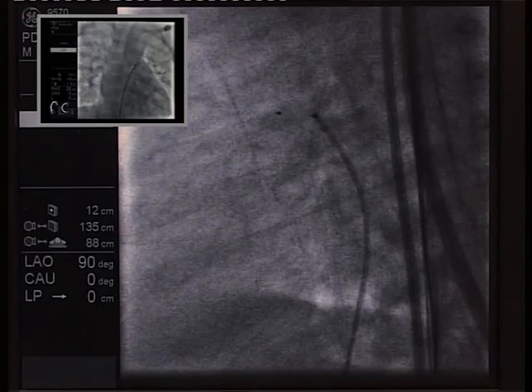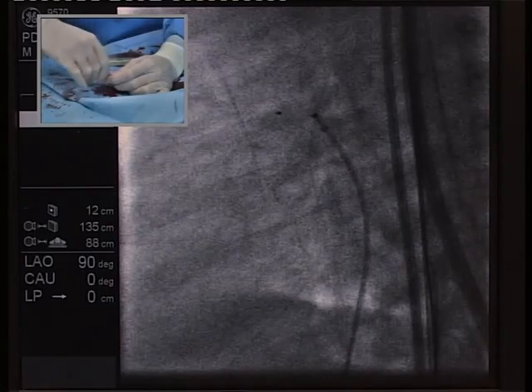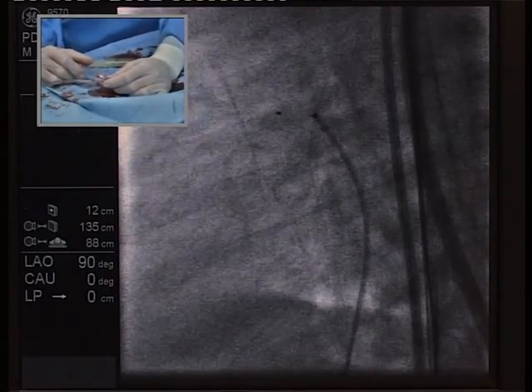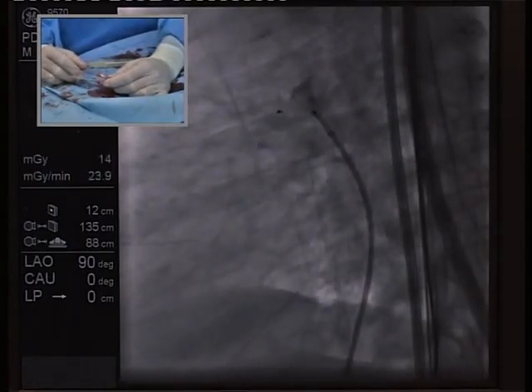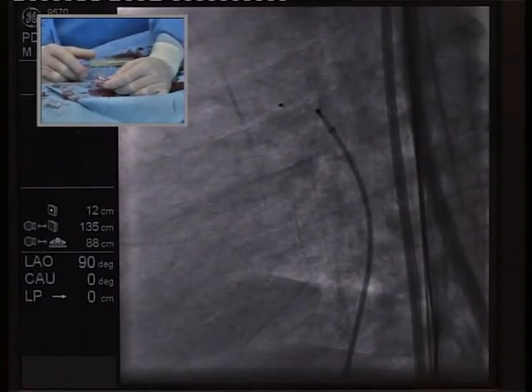Okay. So, just looking at the device and the configuration, I would predict that the middle waist of that is on the aortic ampulla side, not in the narrowing. Yes, our idea was to put one disc on the pulmonary side and the other two discs in the ampulla. What we would like to. Yeah, like this. What do you think? Do you like it?